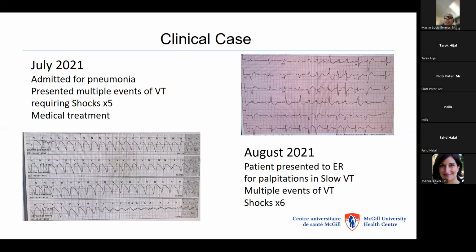So it's just highlighting how challenging it is to define the right amount of scar that you're going to target that's clinically relevant without radiating too much. And there's an upper volume that we try not to cross in terms of having treatment plans that are so broad that you're irradiating too much of the heart, over a concern that this might be associated with worse clinical outcome. So you have to be relevant, very selective. It's still very much evolving and challenging to define that.